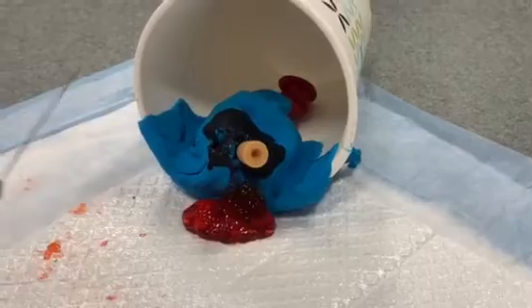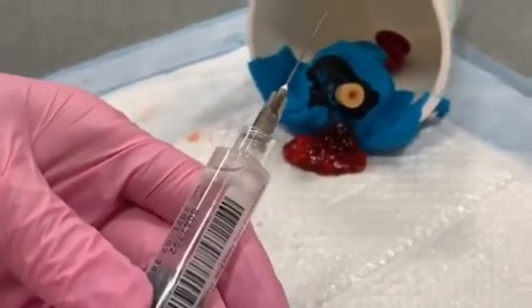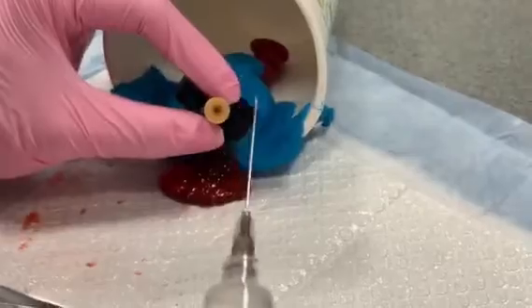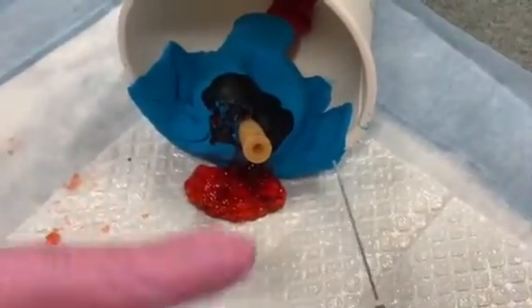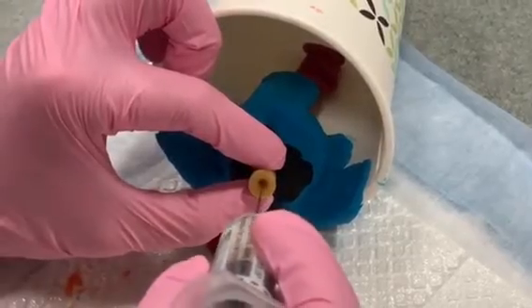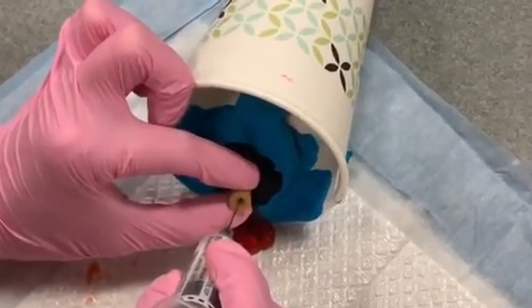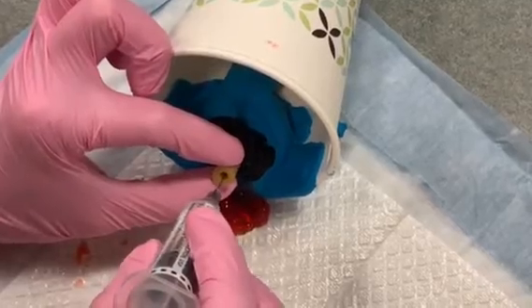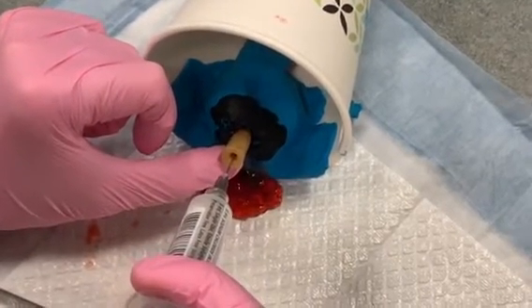You're going to inject into the catheter about 3 milliliters of normal saline, using a 22 gauge 1.5 inch needle. The trick is that you want to place the needle directly into the middle of the catheter, otherwise you may end up puncturing through the catheter and it will not be useful. My needle is in the middle of the catheter and I'm going to inject the saline to blow up the balloon.